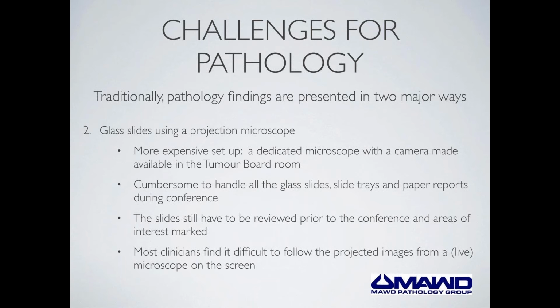I have seen pathologists scatter to find the right slide in response to a question from an oncologist or a surgeon, and the moving images, since they're being projected while the pathologist is moving the slide on the microscope stage, often going in and out of focus, it makes non-pathologists a little queasy.